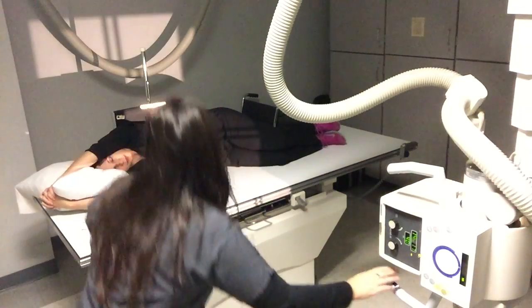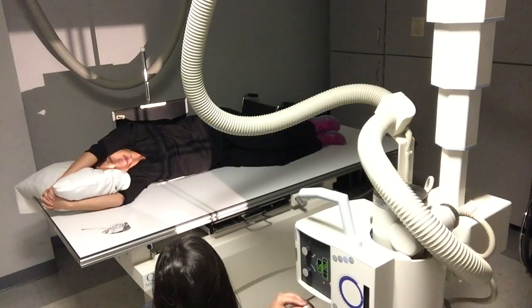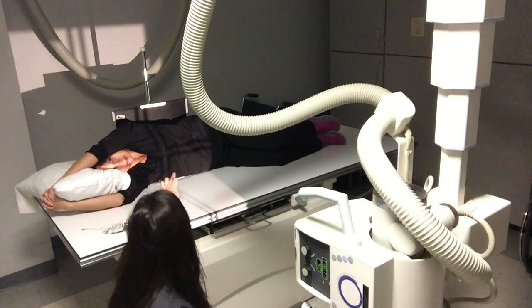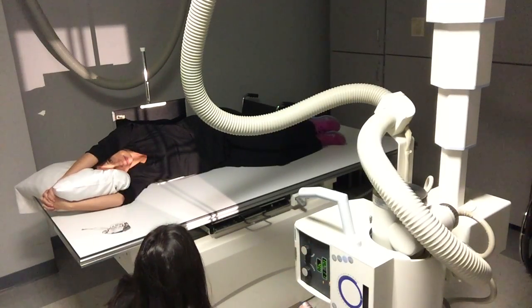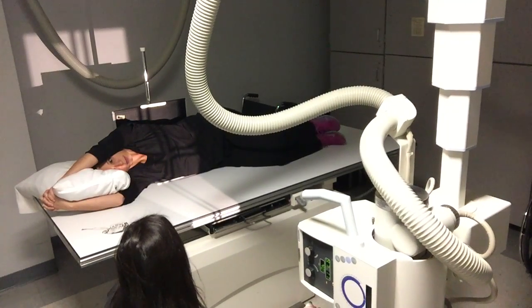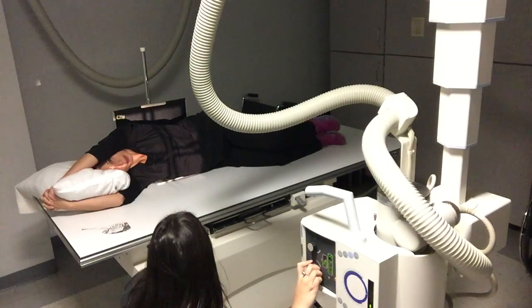Now I'm looking at my tube and getting lined up. I'm centering about three inches below the jugular notch — I'll look at where her sternal notch is and go right below it, just like we do for a regular AP chest. I'm also bringing my tube down so that the midline of the tube is at the midline of her body, and then I'm going to check my SID.